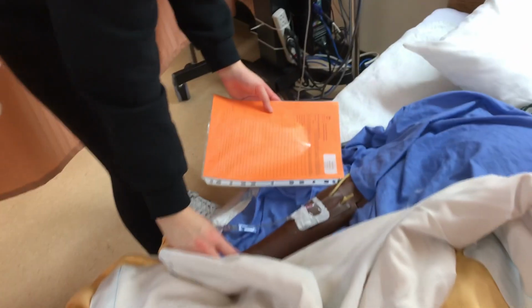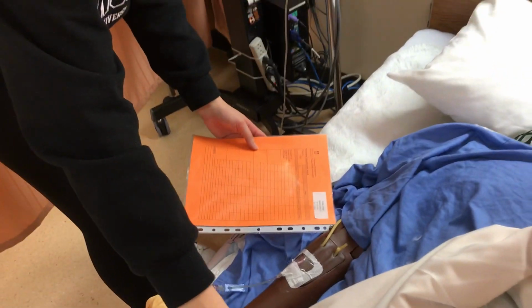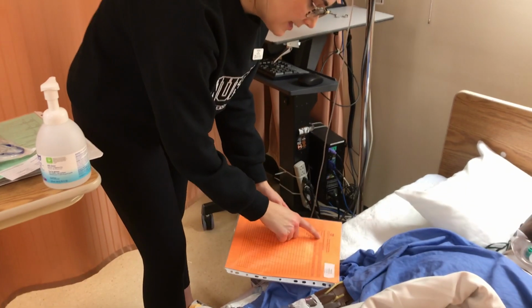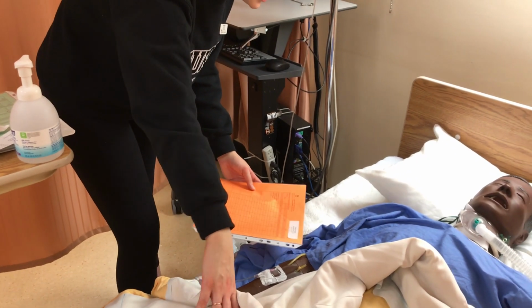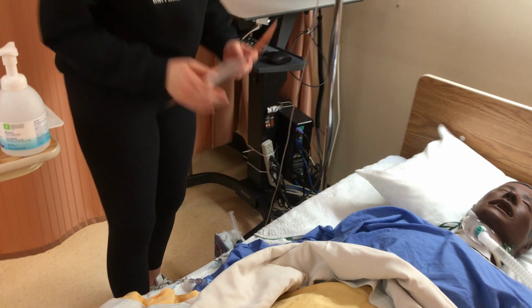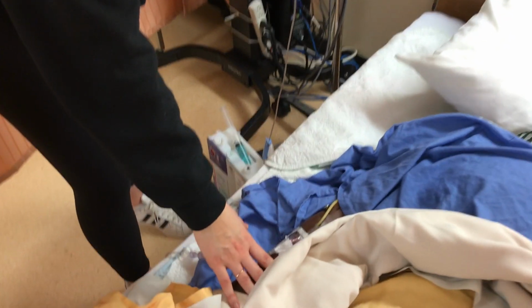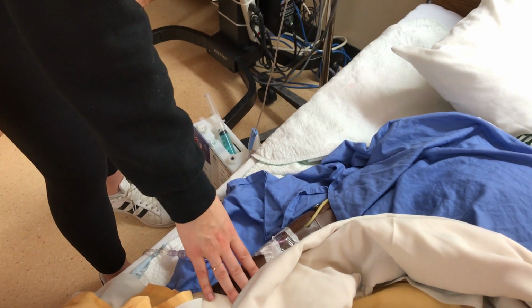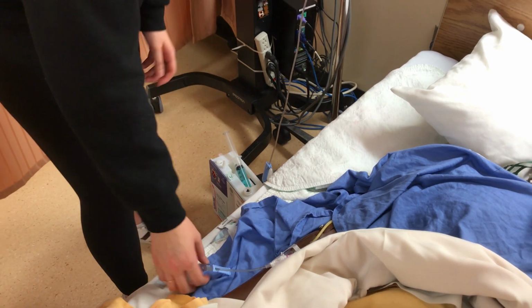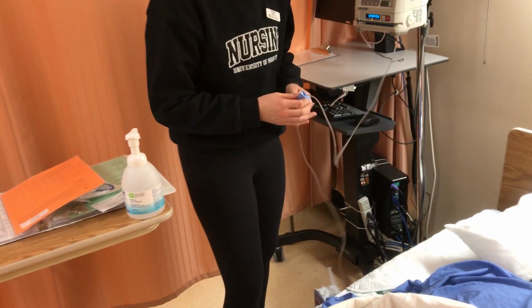So can I get you to say your first name and last name, please? Perfect. And your date of birth? Great. And we have the right patient here, and they have no known allergies. Do you have any other allergies? No? Perfect. Okay, so while I'm down here, I'm going to check the IV site. I'm going to make sure that there's no irritation or inflammation. I'm going to ask the patient, are you experiencing any pain or discomfort at the site? No? Perfect. And I'm also going to be checking the main line for any kinks and any air bubbles.